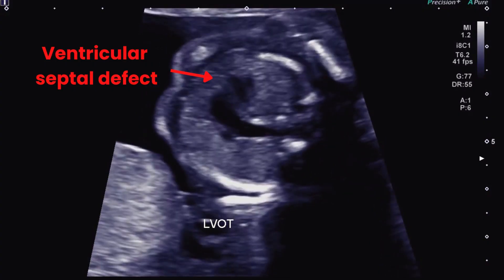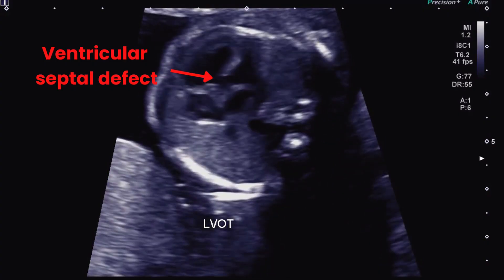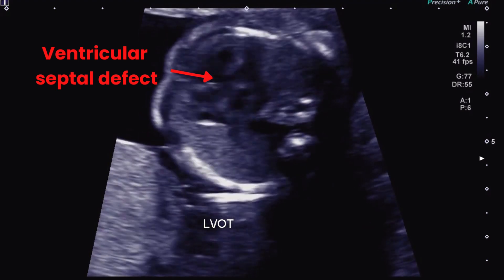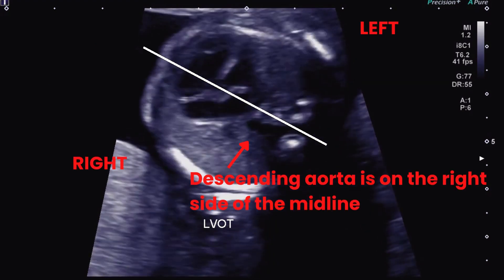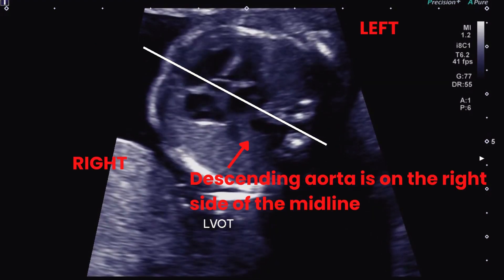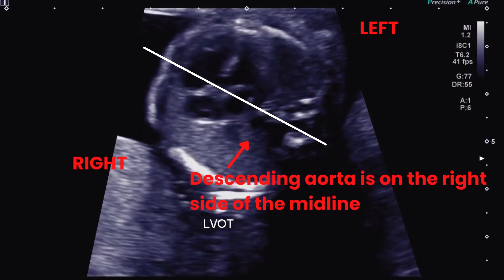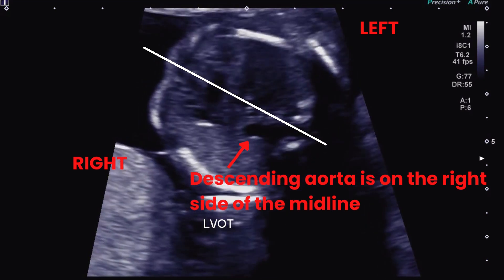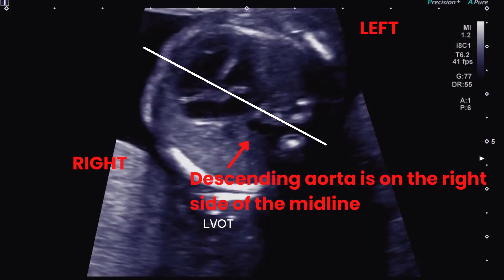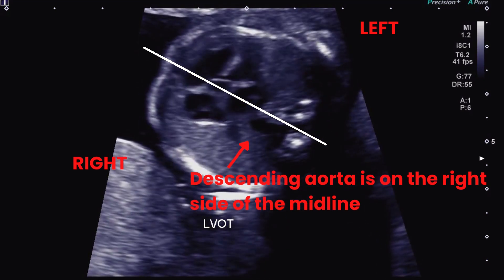This is a subaortic membranous ventricular septal defect. The descending aorta must always be on the left side of the midline. As you can see from the clip, the descending aorta is on the right side of the midline. This is abnormal.